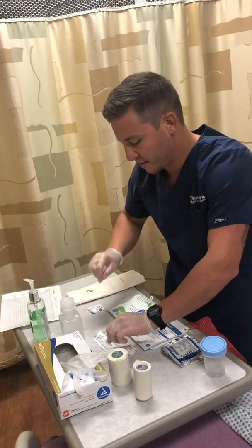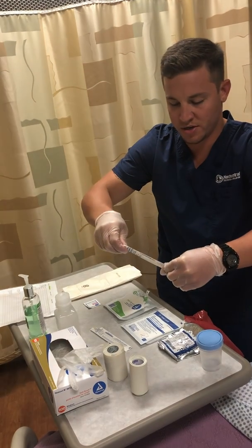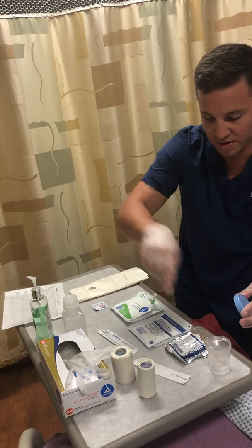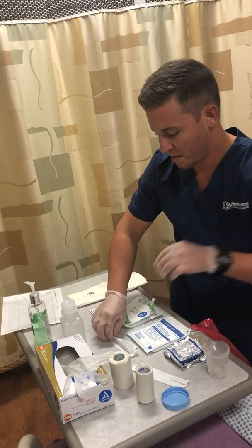We also have some cotton tipped applicators, making sure you only touch these ends here.